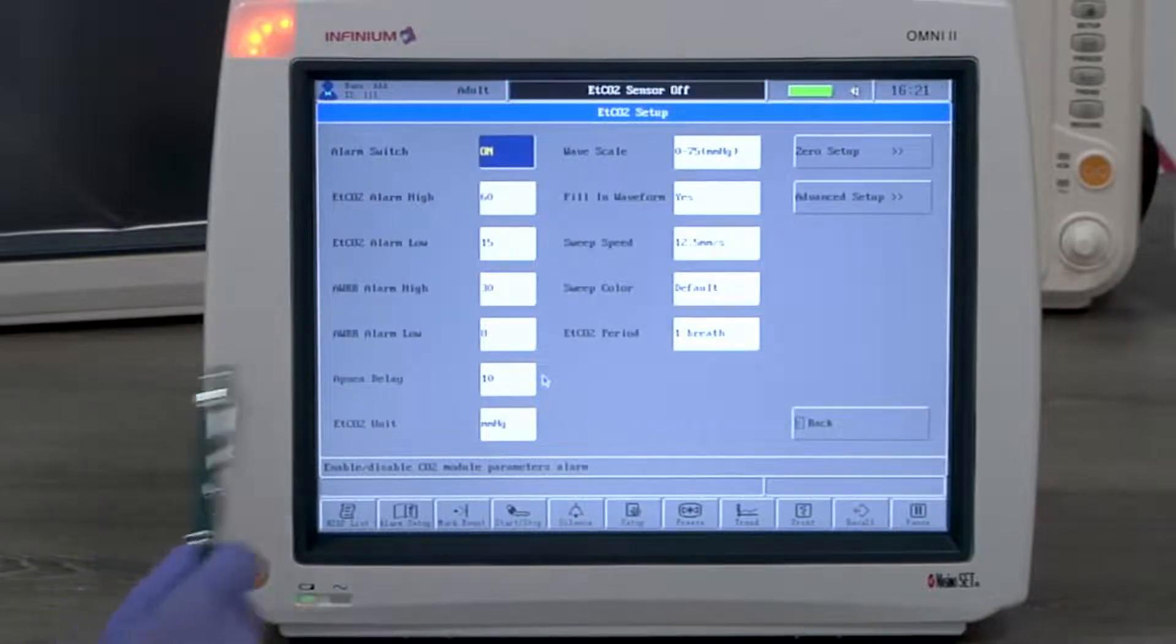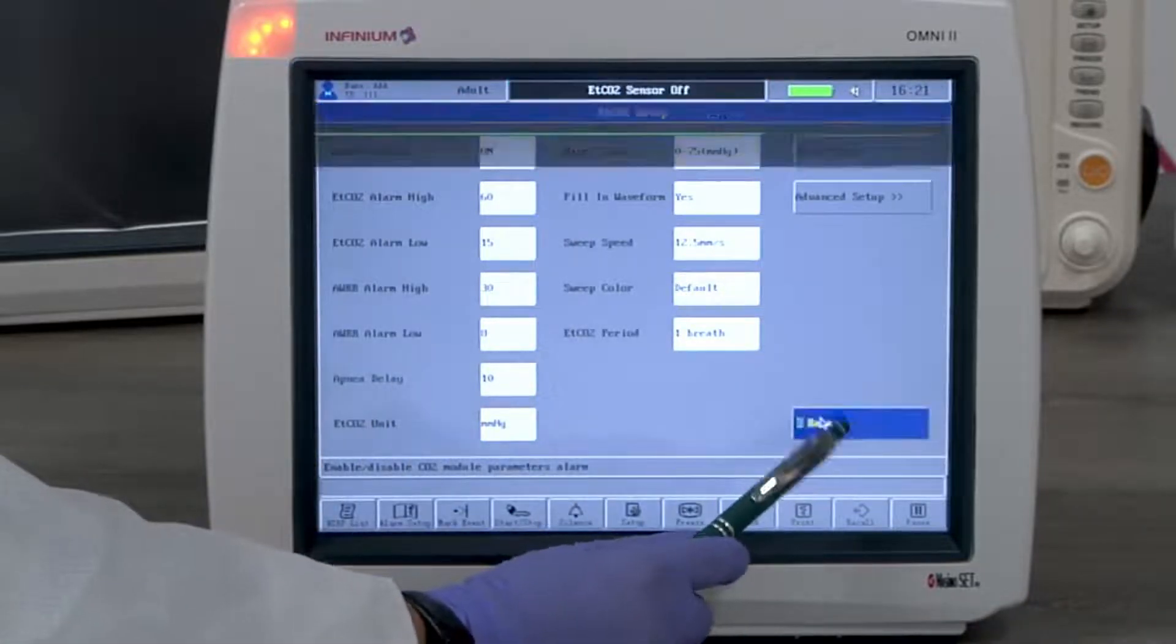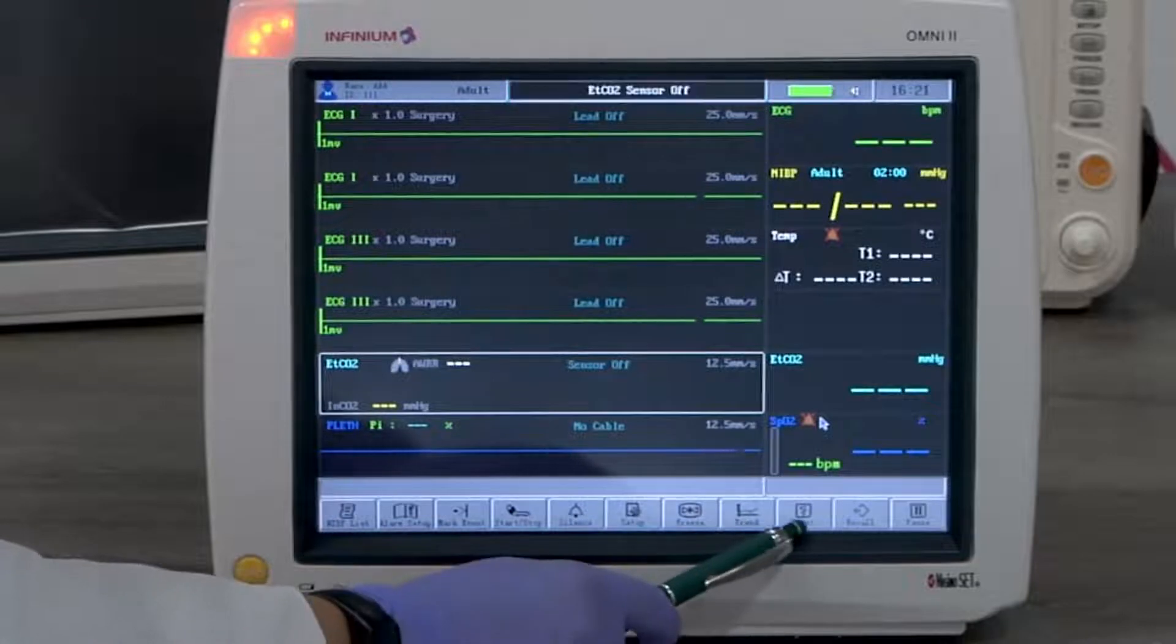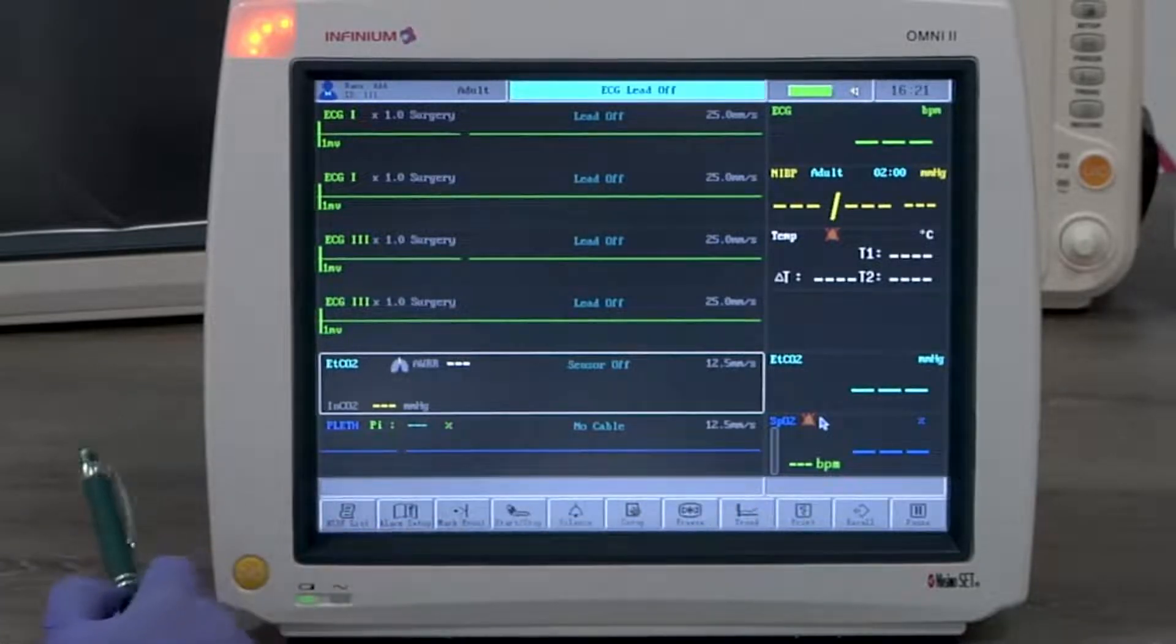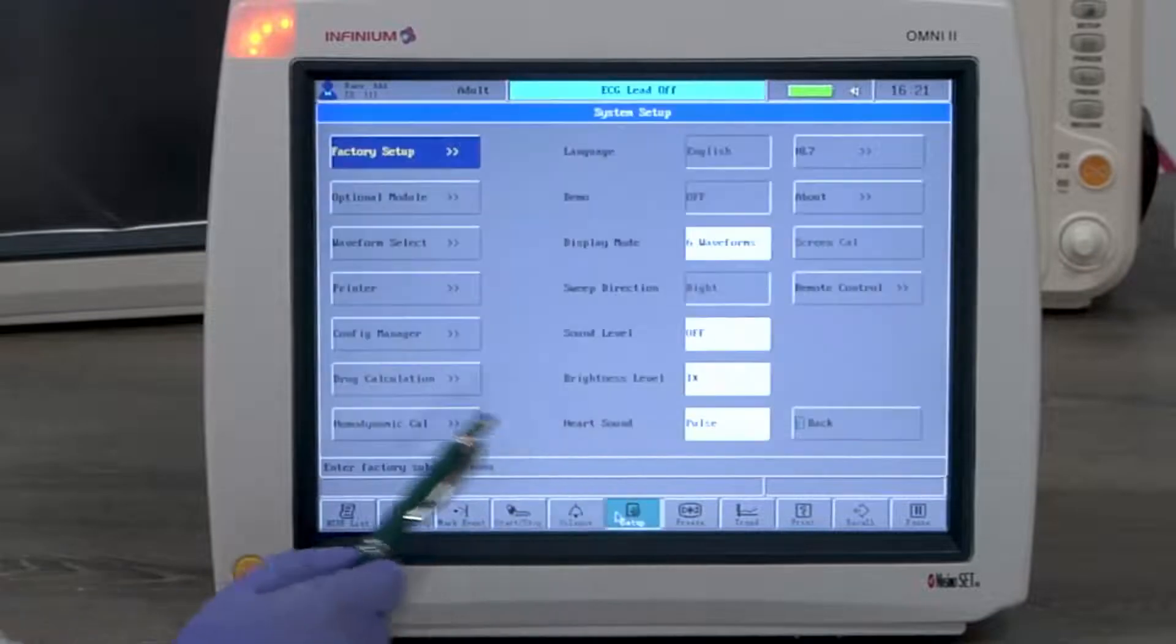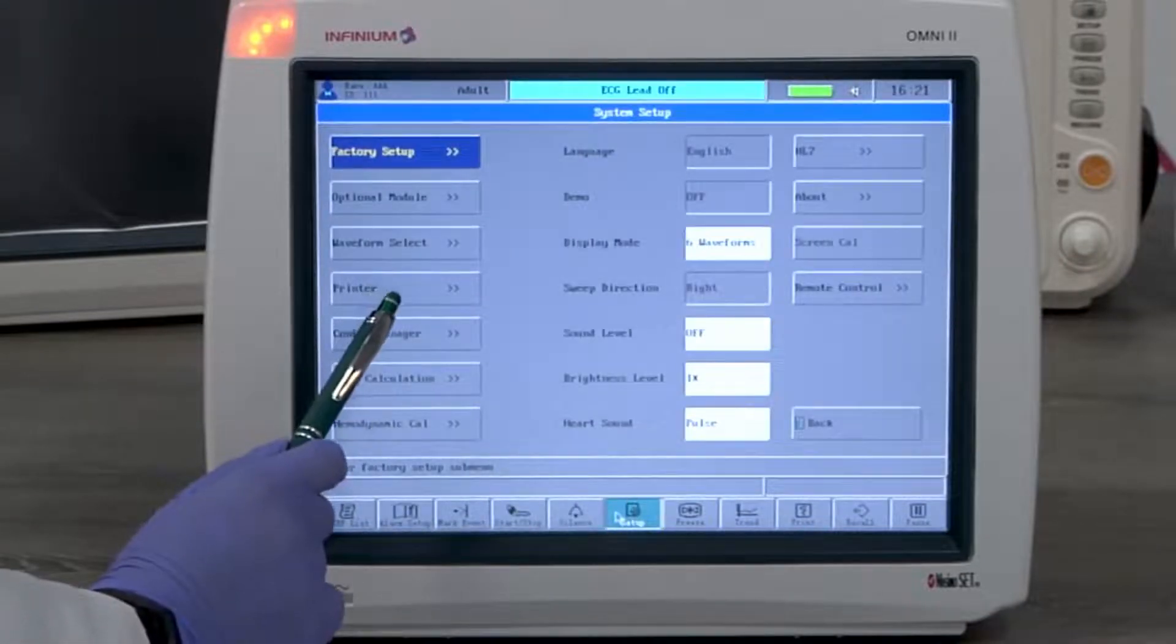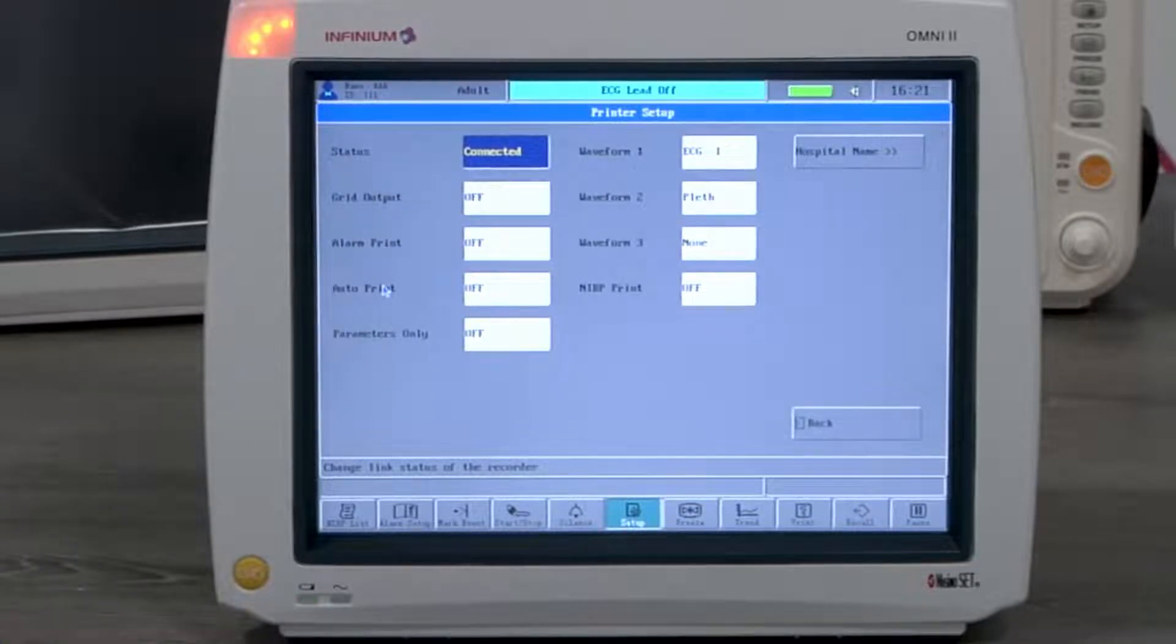Now let's take a look at printing. The print button activates the printer to print an eight-second real-time waveform and reading. Printer settings are under the setup menu. The status will be connected if a printer is installed. All options will be available. When there is no printer installed, the status will be disconnected and no option will be available.